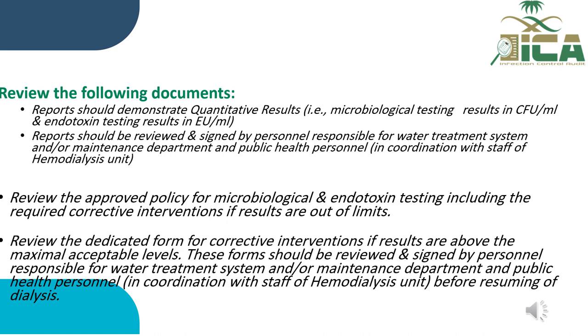Reports should demonstrate quantitative results. Reports should be reviewed and signed by personnel responsible for water treatment systems and maintenance departments and public health personnel.